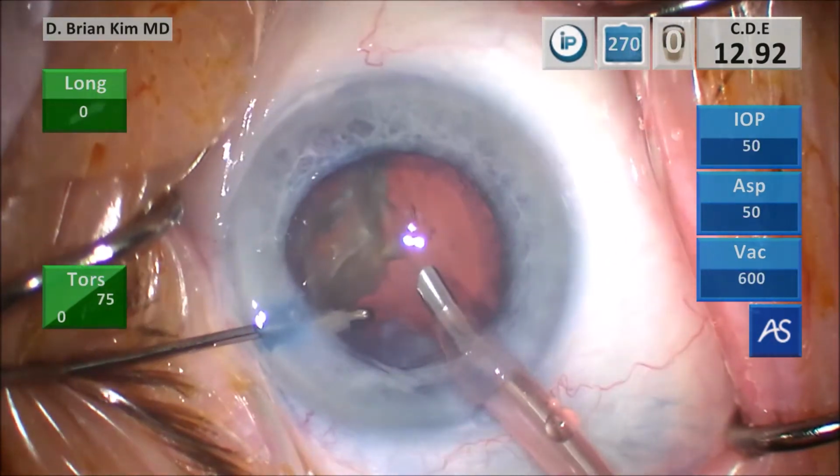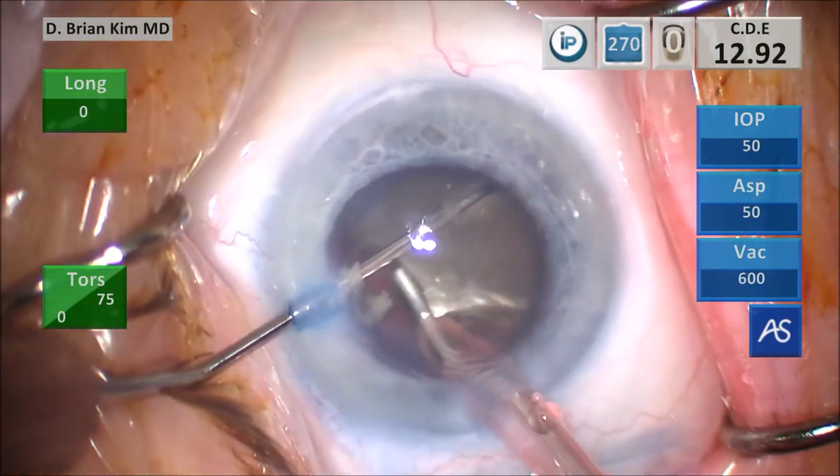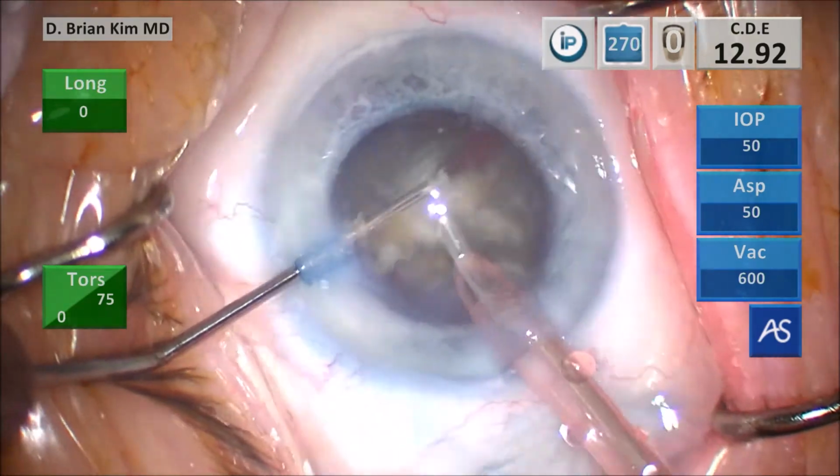Turning that last quadrant in front of me, placing the chopper around the lens, hooking the peripheral lens, pulling it centric toward the phaco tip, which is deep in the bag, and then the lens is broken completely in half.